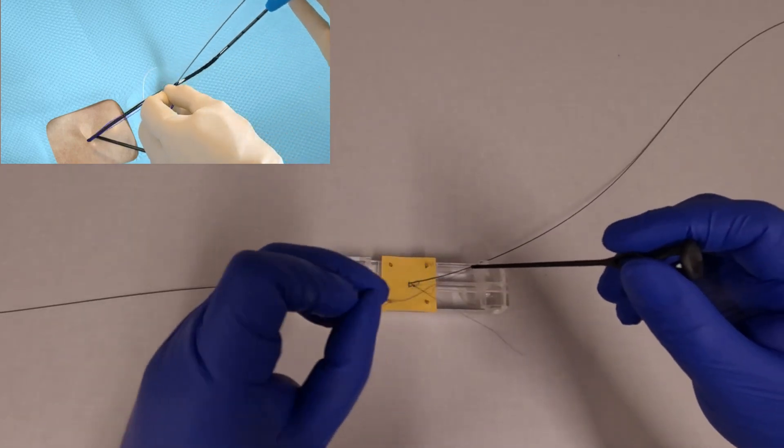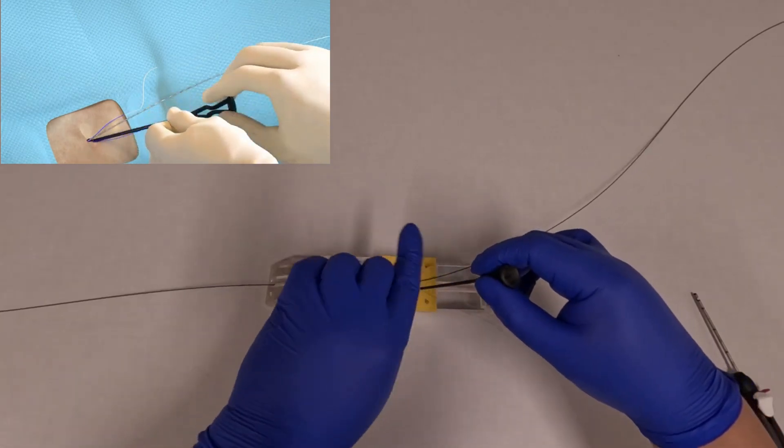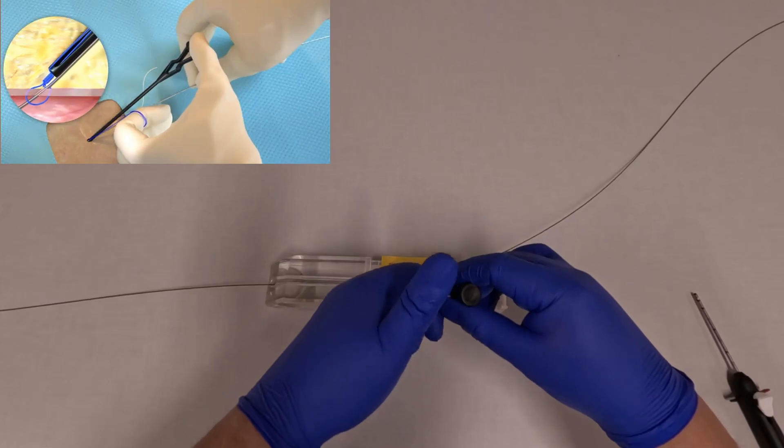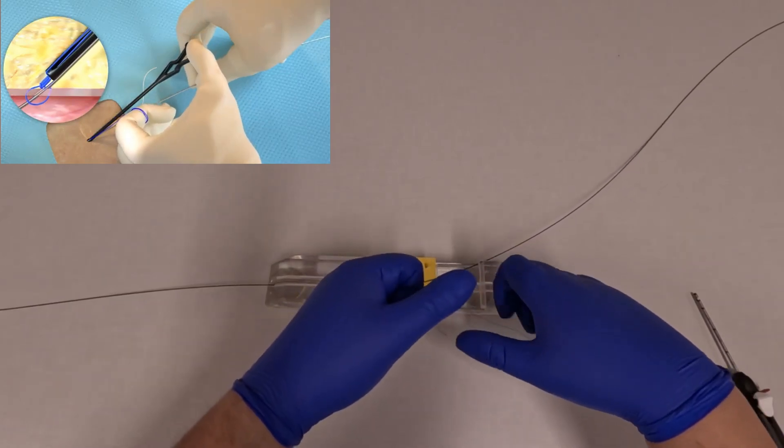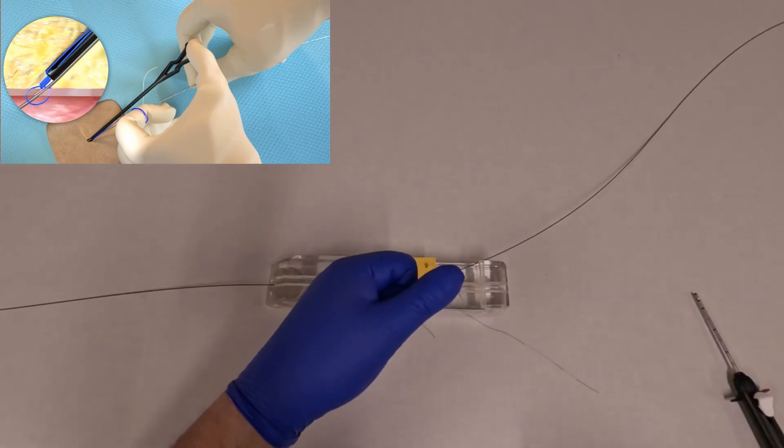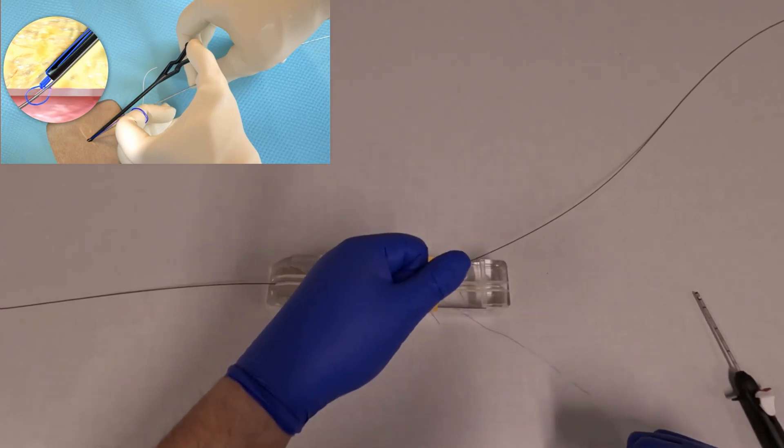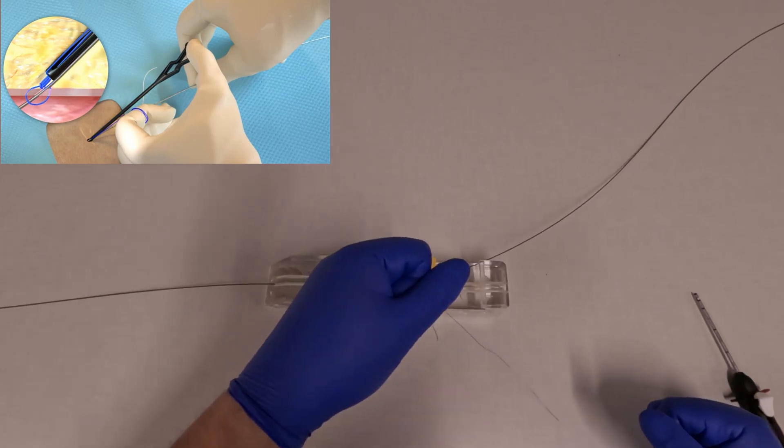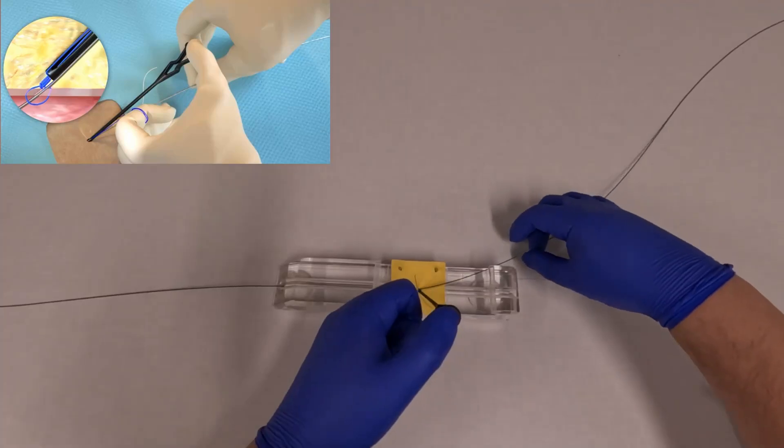Now for all the steps when we're manipulating using the tools on the suture, you want to have a firm grip on the suture. So what I do is wrap a couple loops around my finger, hold that with my hand, and then use the thumb of the same hand, my left hand, on the tool. You want about guitar string tension on the suture, and you're pushing down with your thumb, pulling up with the suture. What this step does is push the knot down on the blue suture, all the way to the arteriotomy.